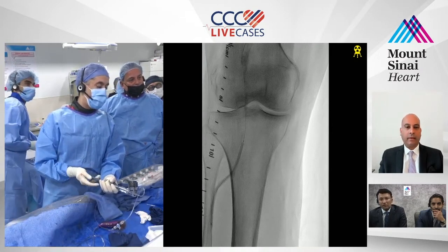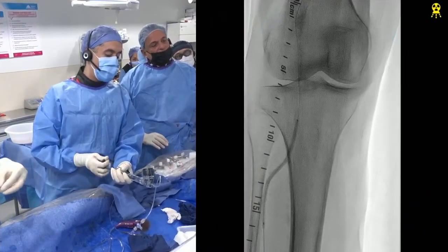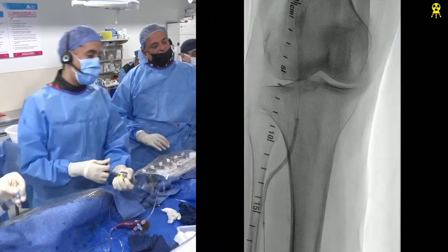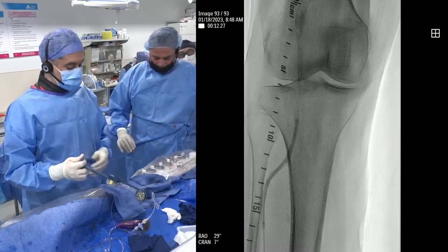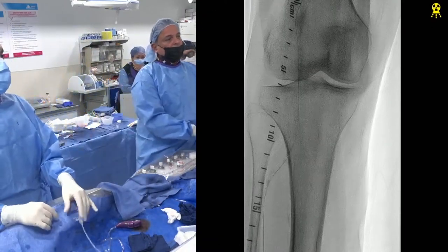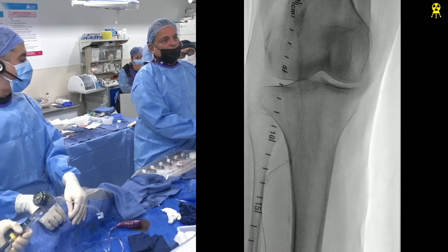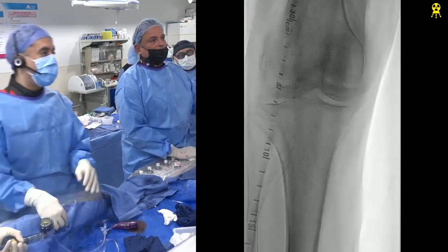Look at that. Look how tight that was. That's tight right there. Yep, by the ostium. Because if you come from above, even with the pedal access, even with the micropuncture access, you can use a coronary balloon to go through a micropuncture access and use a 5-0 balloon. I think we just balloon it all the way up. Yeah, exactly. Balloon. Create a CART technique.